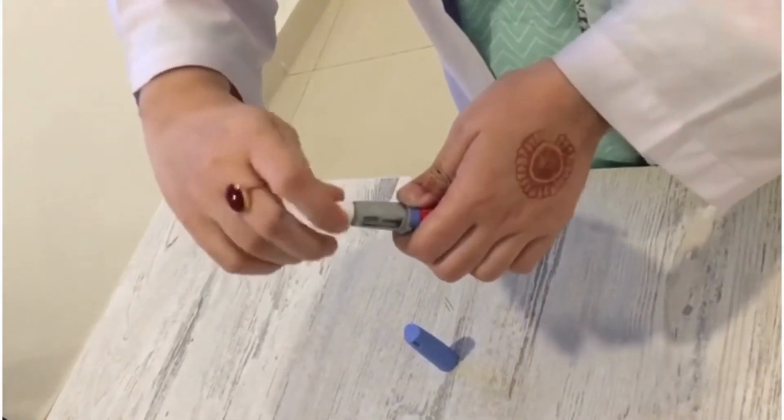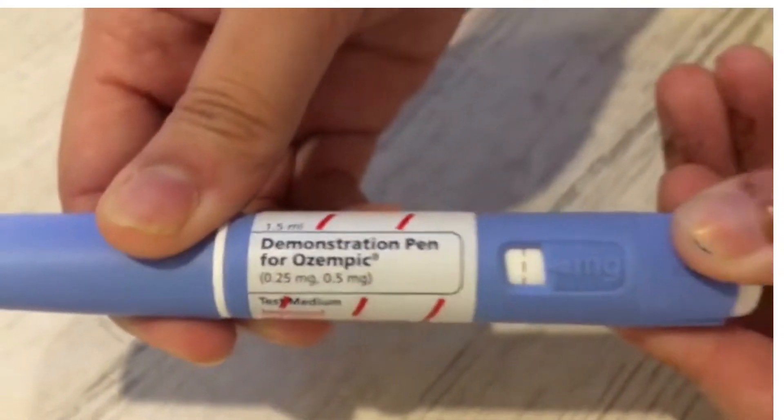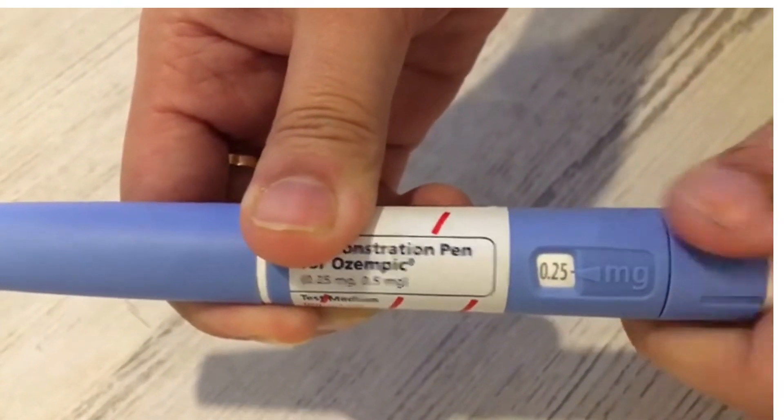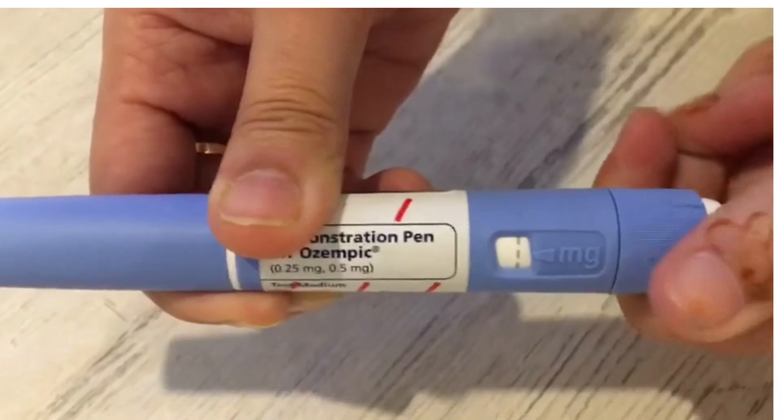Fix the needle cap by rotating clockwise, then rotate until the end and adjust the dose to 0.25 mg. The dose is now set to 0.25 mg and the pen is ready to inject the dose.